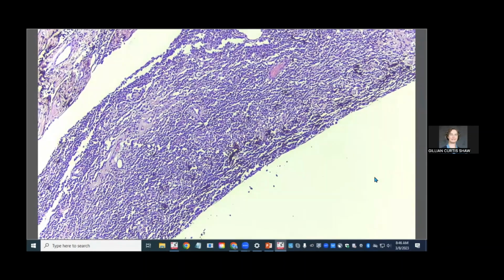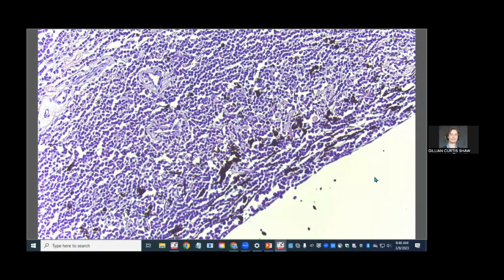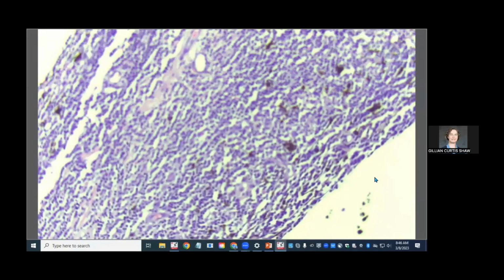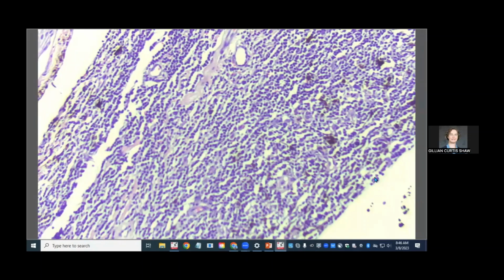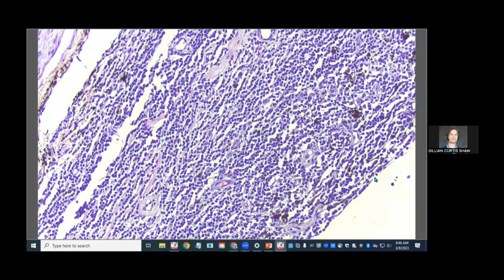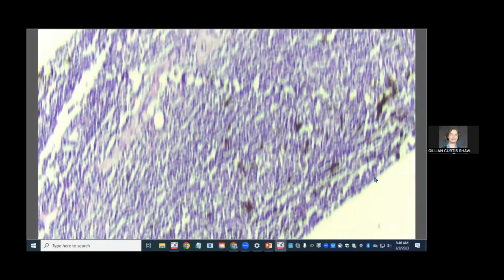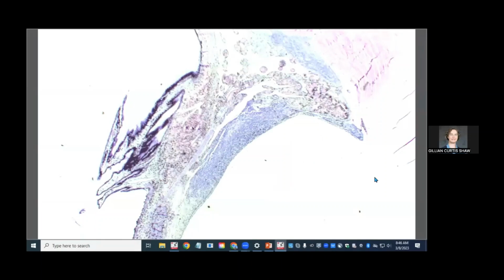So we commented on some of these somewhat atypical features of this pretty severe uveitis. However, the most likely reason it looks like this is because this guy has had chronic, very long-standing lymphoplasmacytic uveitis, probably lens-induced. Just pointing that out, there was a mitotic figure over here. I'm not going to spend our time trying to find it. So that's the cellular infiltrates.